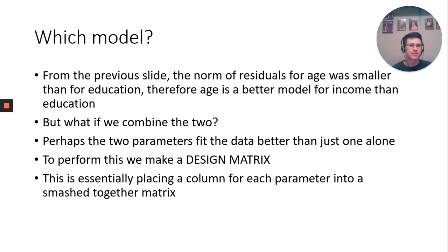But how do they look together? So we're going to make what's called a design matrix. A design matrix is actually very simple in this case. It can get more complex, and we'll make it more complex down the way.